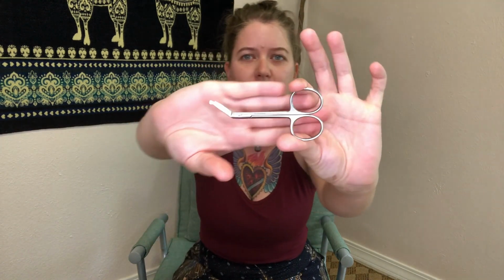So first and foremost, they gave me a pair of medical appliance scissors. These are safety scissors, and these ones in particular are by Coloplast. These are by far my favorite safety scissors, and these ones the hospital gave me. They're really great because they're curved, as you can see, kind of curved this direction. The actual scissors part themselves is very small. It's something you can actually take on an airplane. Also, I recommend that you have not one, but 2 pairs of safety scissors. I have lost my safety scissors before. It really sucks. It's really hard to try to cut an ostomy wafer with a regular pair of scissors. So I would highly recommend that you get 2 pairs of these scissors.